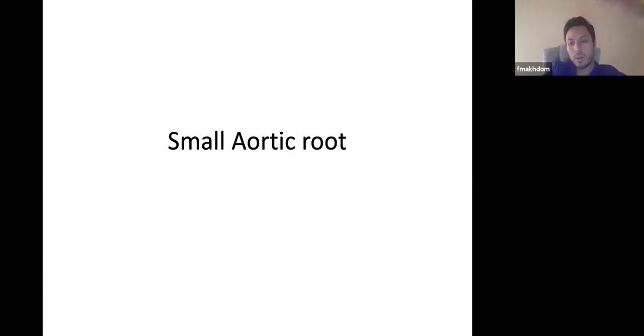Or if you have experience and are in a luxury hospital, you can do a homograft. So the options: aortic root enlargement, mechanical valve is better, stentless valve, sutureless valve, or root replacement. It depends on the case, but this is usually the typical answer for small aortic root options.